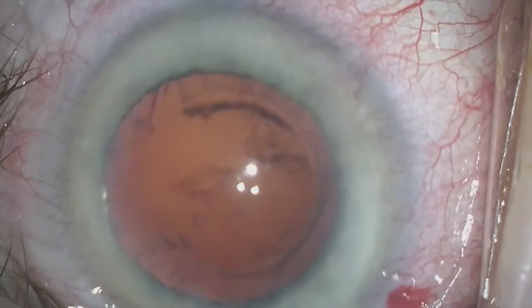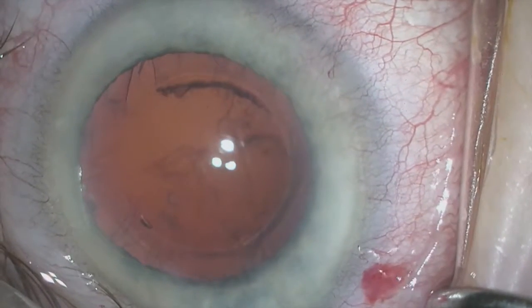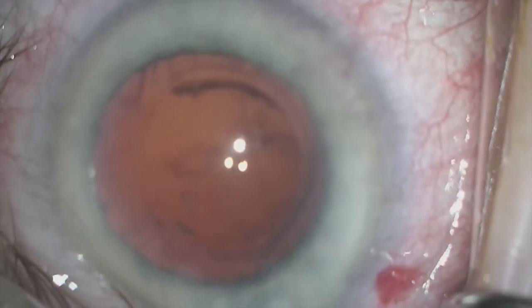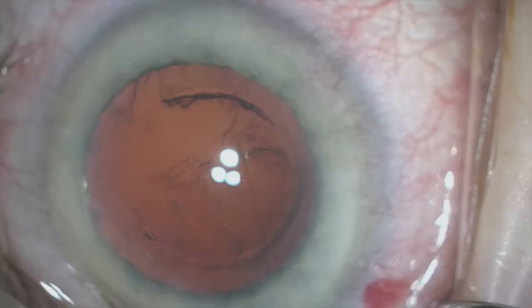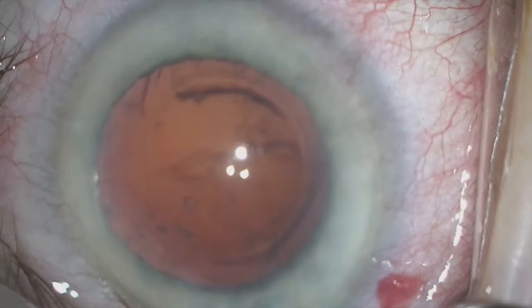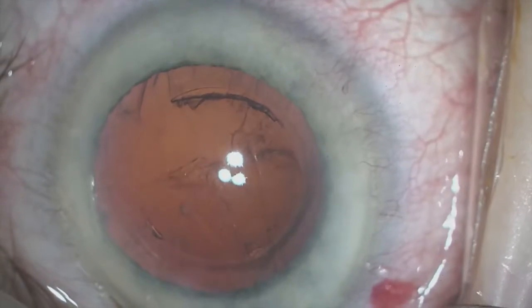This cube is a small cube that we see with the current fragmentation pattern that I use with the LensX laser. At approximately 10:30 in this part of the clip, you will see what appears to be an anterior capsular rent, but this is an optical illusion created by the remaining cortex. You will see this disappears as we eventually use our I/A handpiece to remove the residual cortex.